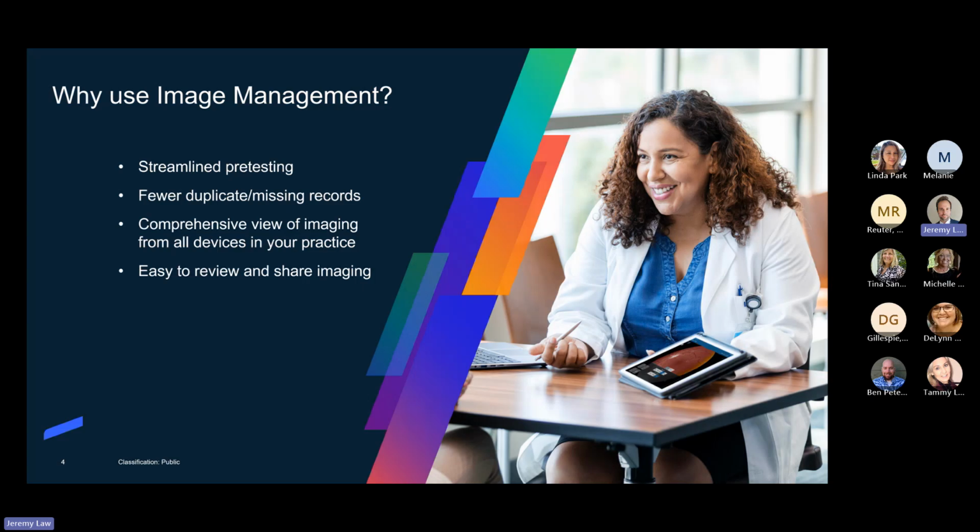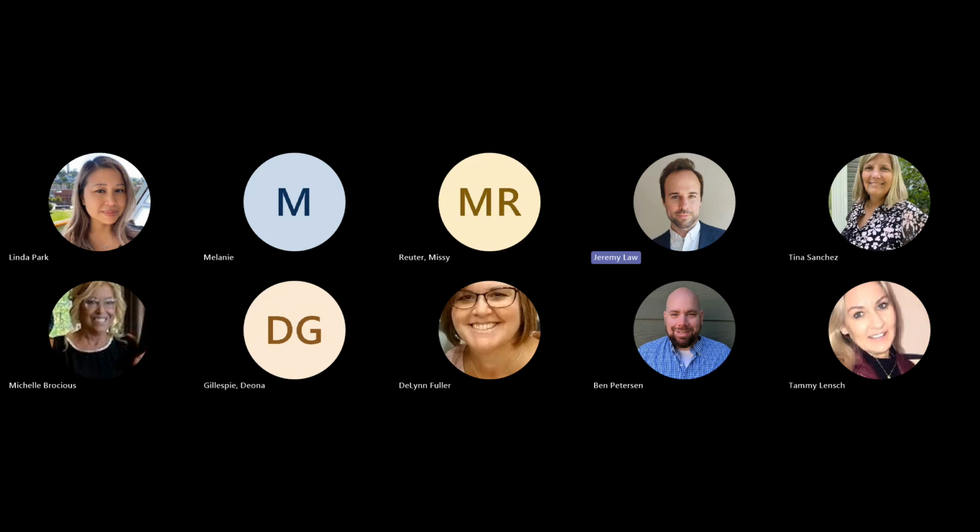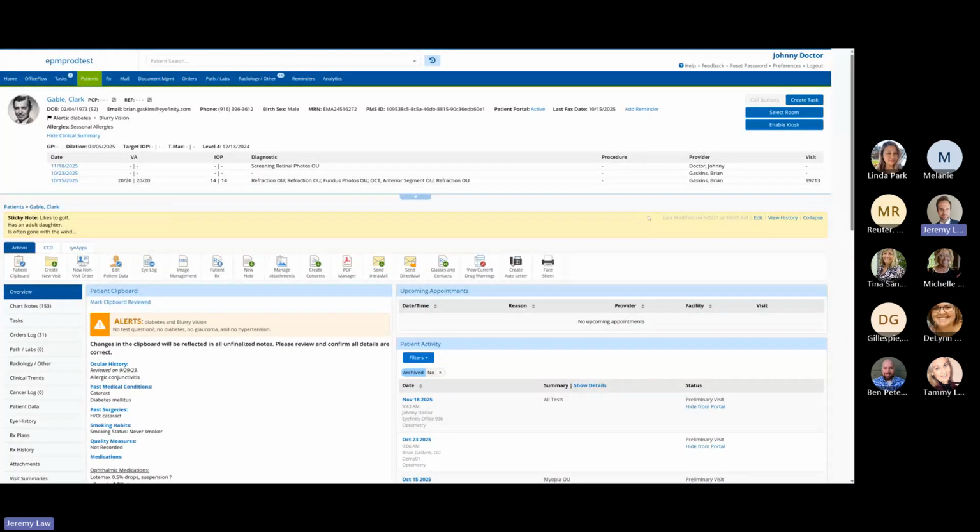So let's go ahead and get into some demos. I'm going to go ahead and share my screen here in just a second. You'll see the screen go black for just a moment, and then you should see this coming up here. Perfect. Okay.